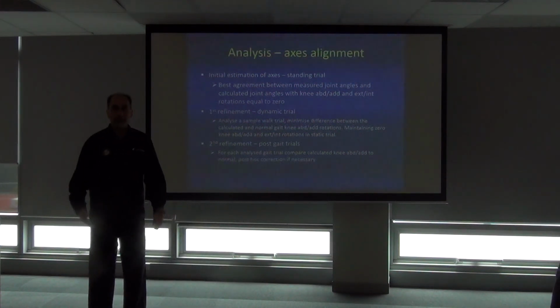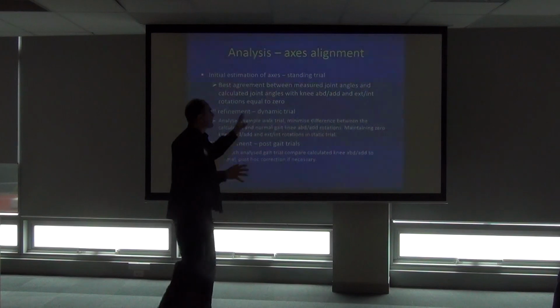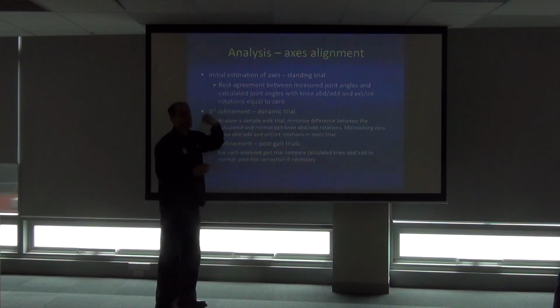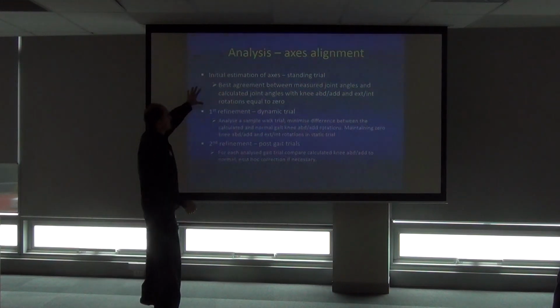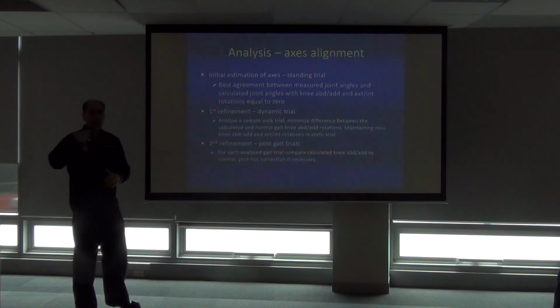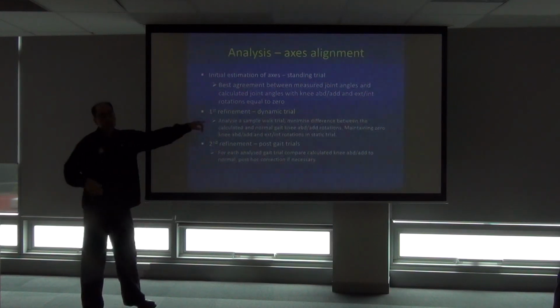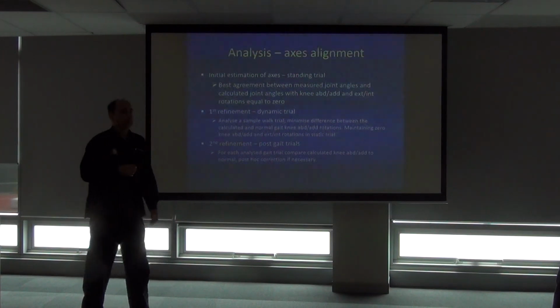So the knee flexion extension, the hip abduction, the foot progression angle, and the rear foot angle. So best fit those while keeping the abduction adduction 0. That's our initial estimate. Okay, then what was done is our first refinement. So what this is, one walking trial was taken and analysed.